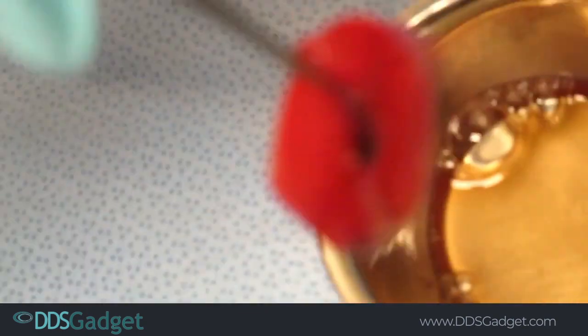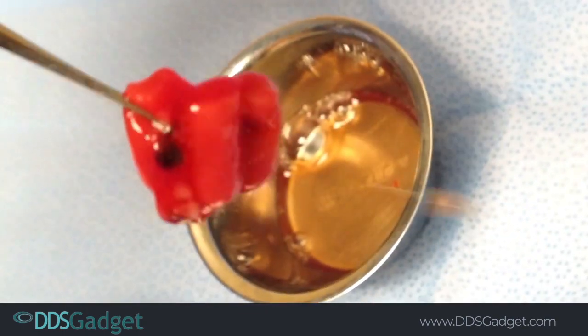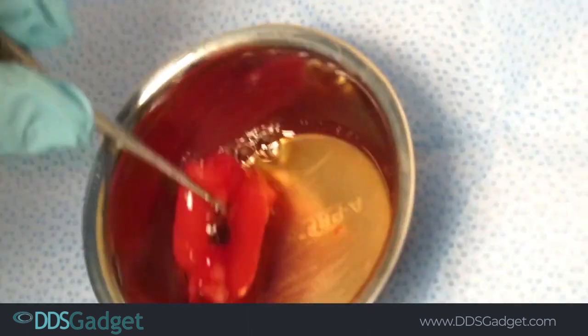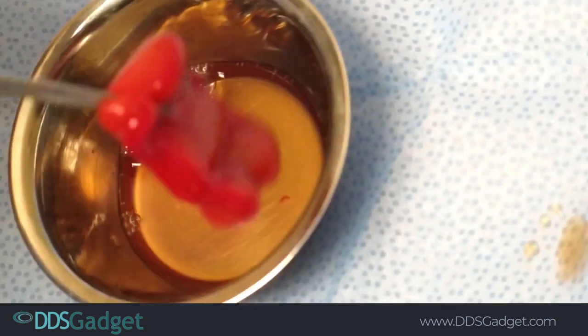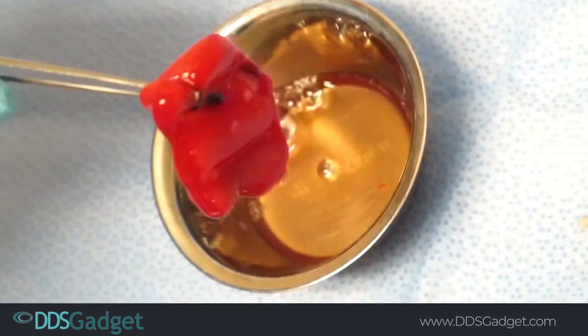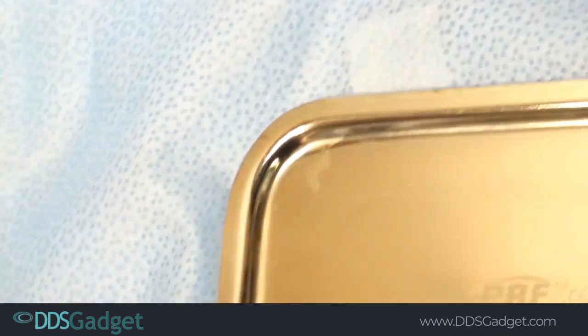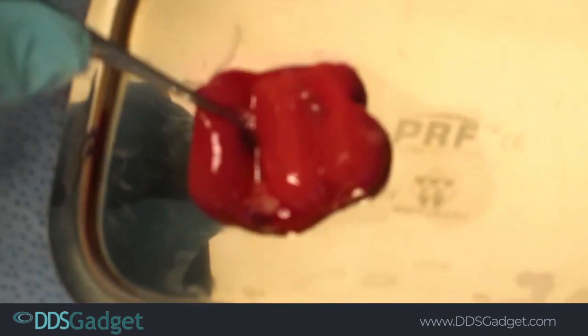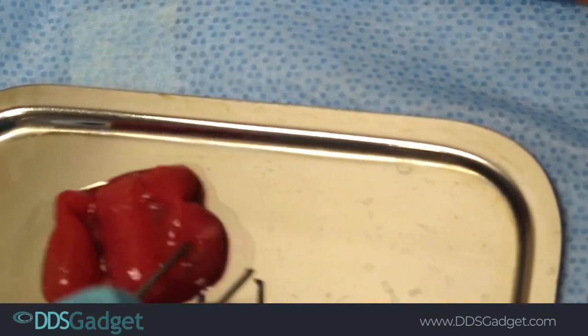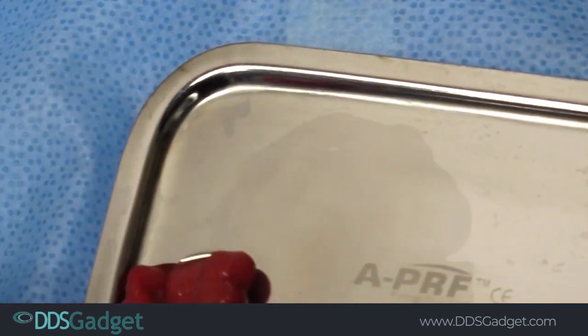Here's the sticky collagen — I infused three collagen plugs. You can see how nice and sticky this is, really really nice collagen infused with IPRF. It's nice and sticky so we can pack that into the surgical site. Here's a great example of sticky bone, or sticky collagen, and our IPRF sandwich.